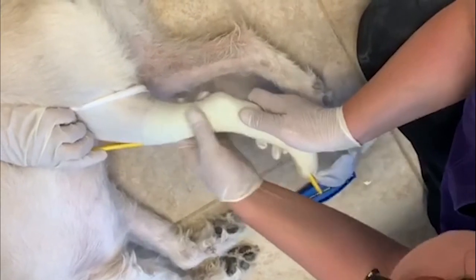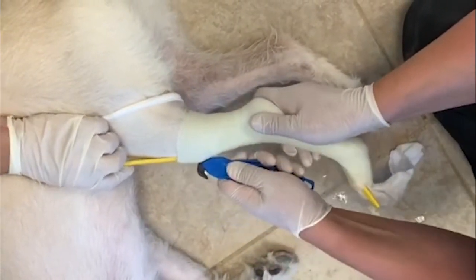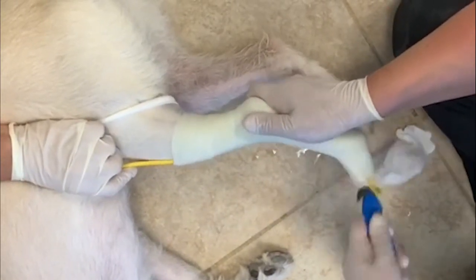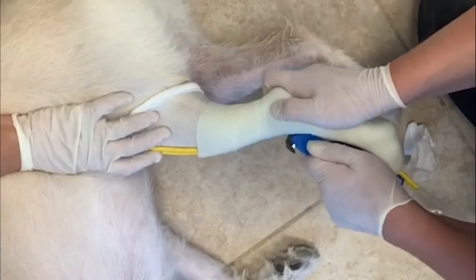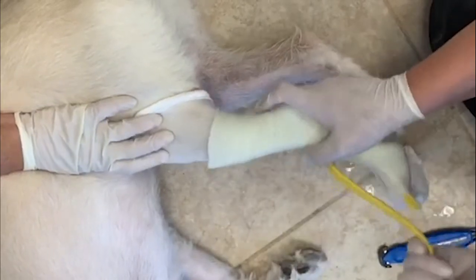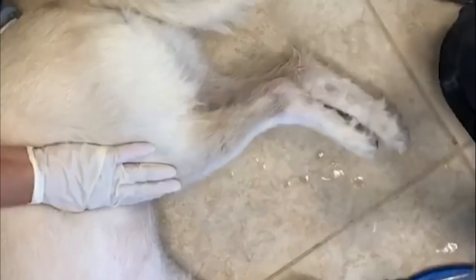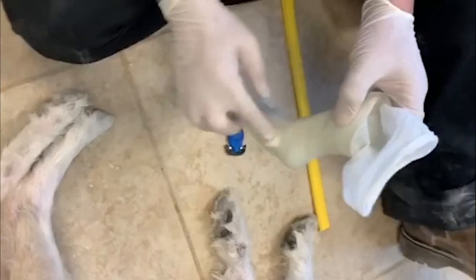Once your cast material has hardened up, you're going to want to take the hook knife and run it down the cut strip. Take the cut strip out and it should just slide right out. There's the hock cast — flex paw, a natural standing position at the hock or tarsus.